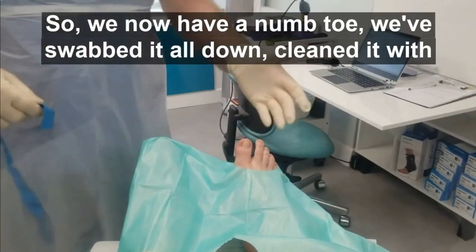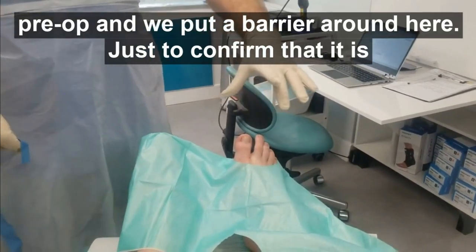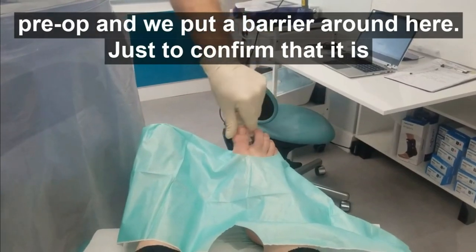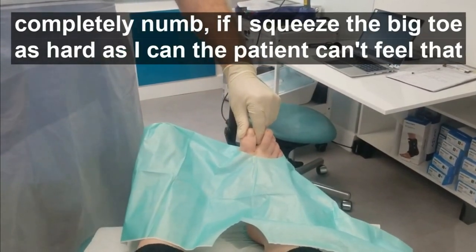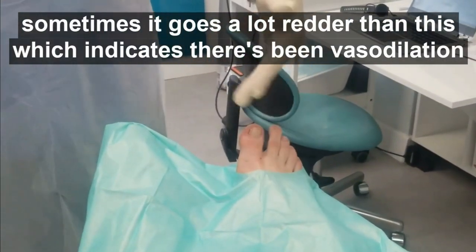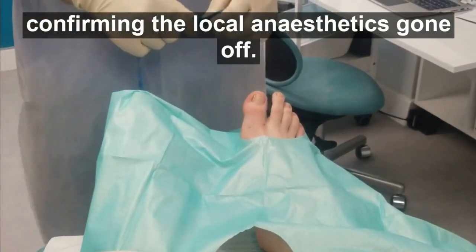We now have a numb toe. We've swabbed it all down, cleaned it with a pre-op, and put a barrier around here just to confirm it is completely numb — if I squeeze the side of the big toe, the patient can't feel that. There's a little bit of rubor in the toe; sometimes it goes a lot redder than this, which indicates vasodilation, confirming the local anesthetic has gone off.